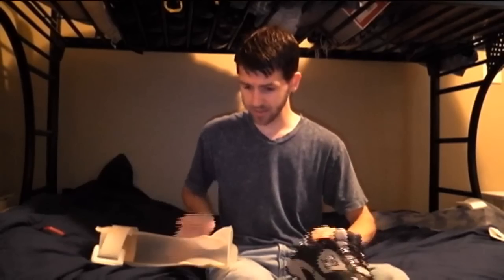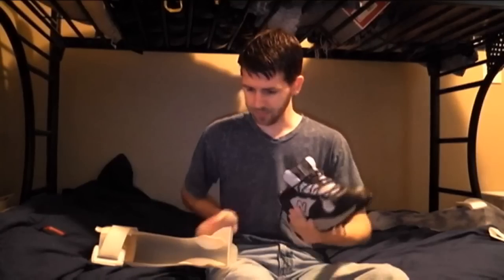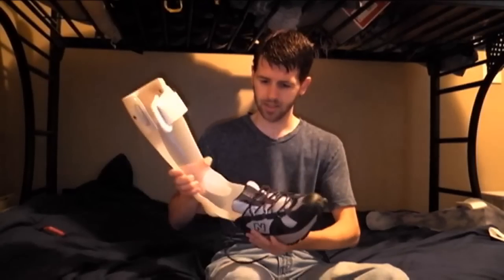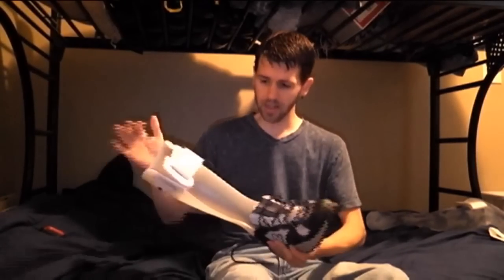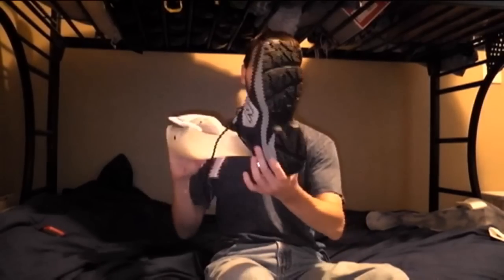I take my leg brace and put it into my shoe and it should fit snugly in there. You can see the shoe is in there.